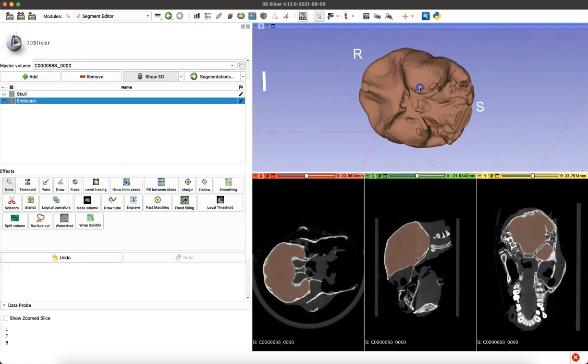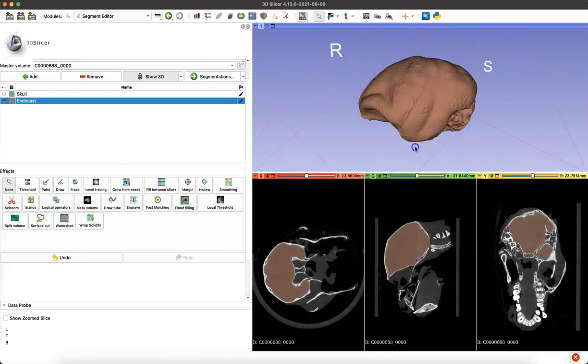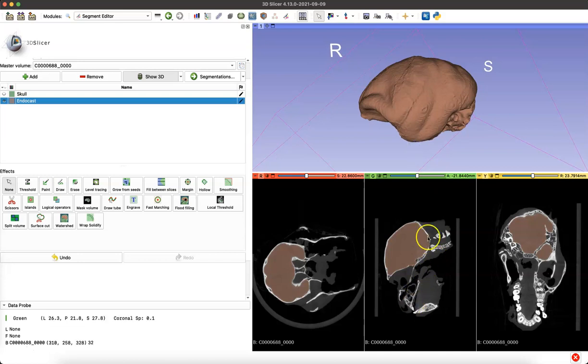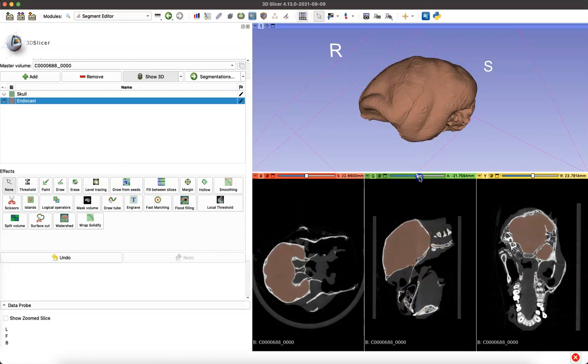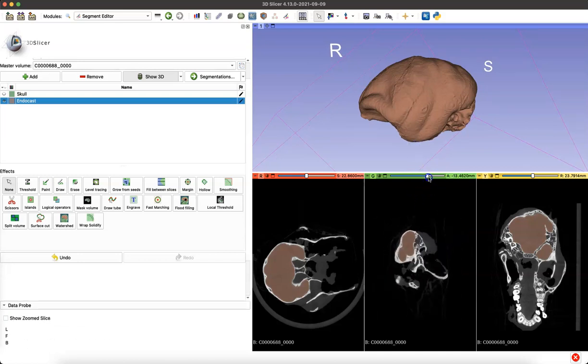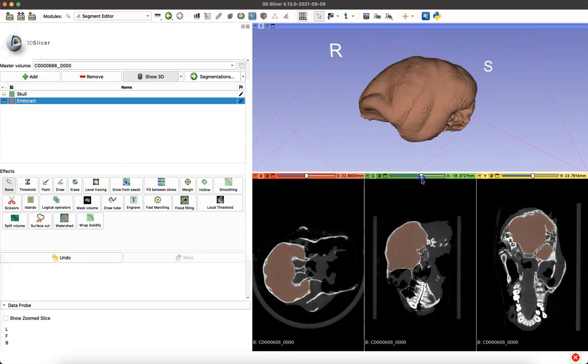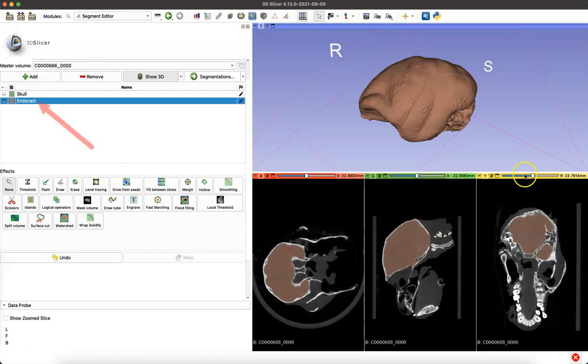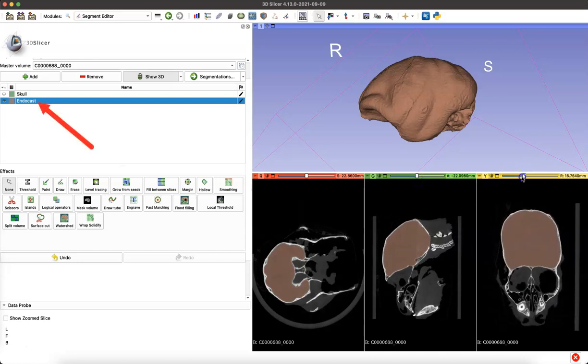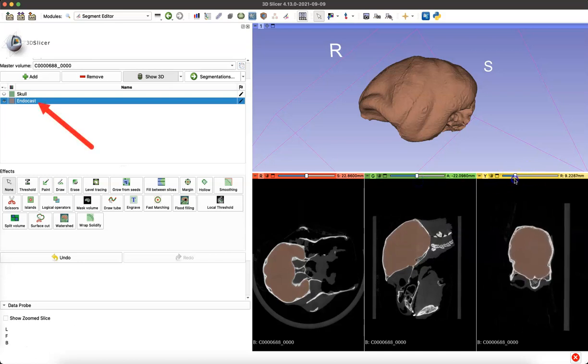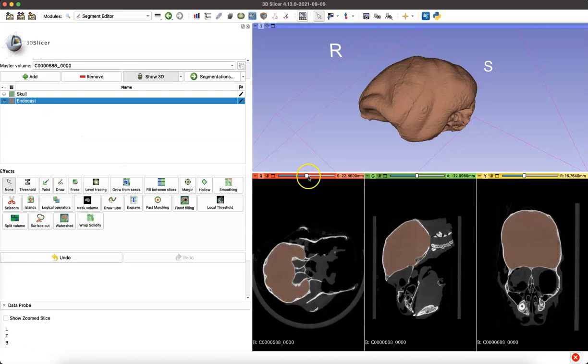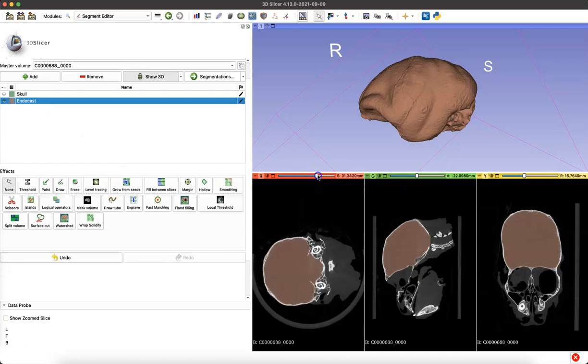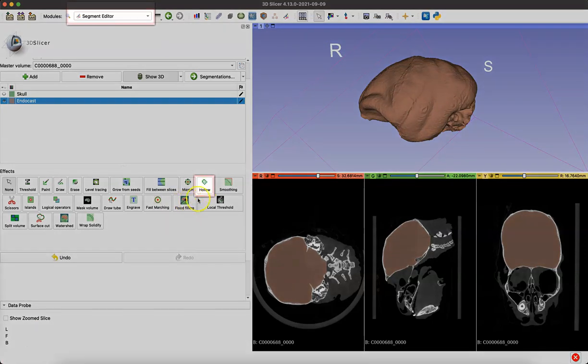We can explore our endocast in 3D space and in the slices below and see that we've created a solid object. Our segment that we created that you can see in the left hand menu, endocast, solidly goes through the skull and we want to hollow that out so that we can easily 3D print it.